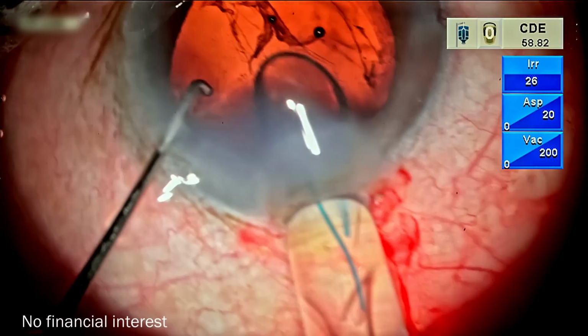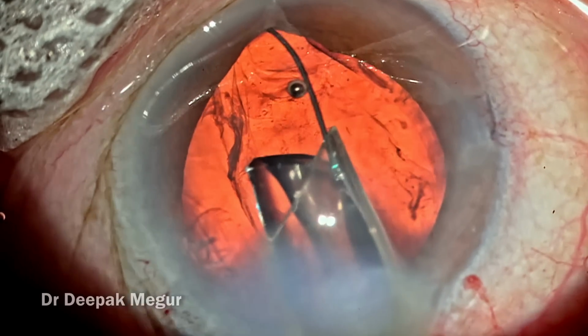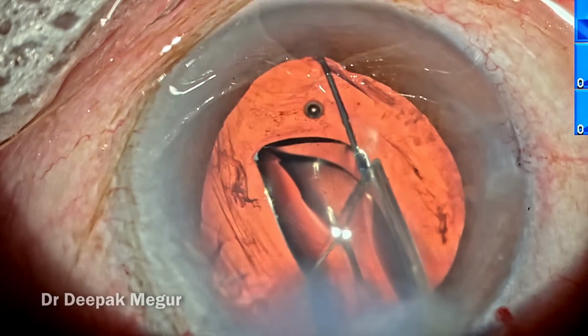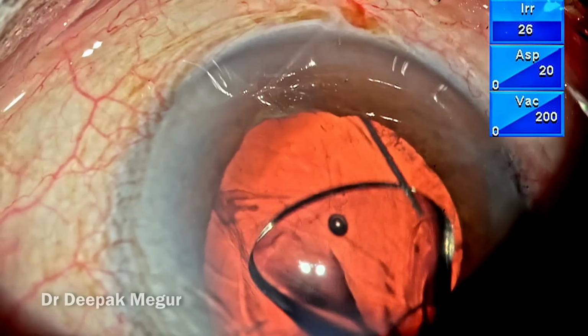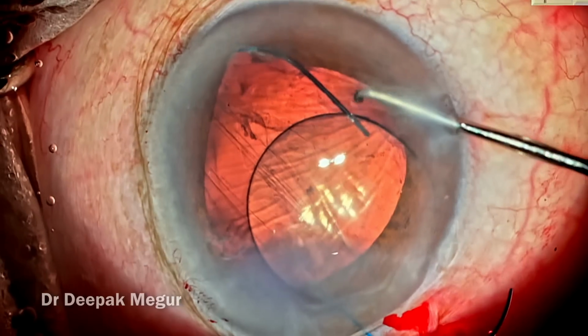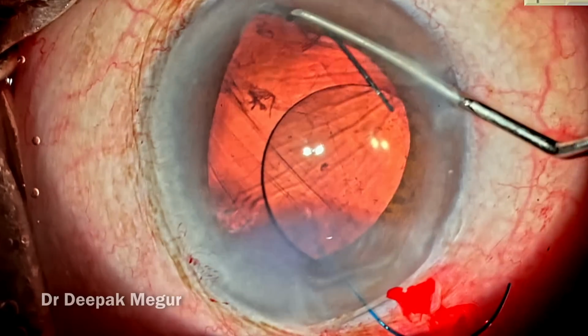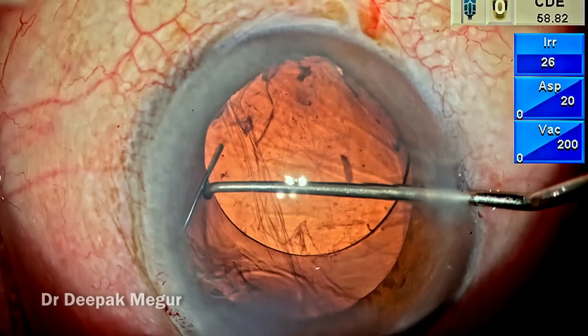This is Aurolab multi-piece lens. So I'm trying to land it over the anterior capsule, but unfortunately it has gone and stuck in the area where the anterior capsular tear is. So with the Sinskey hook, I just lift up the haptic so that it's in a more anterior plane and above the anterior capsule, and then using a Sinskey hook, the second haptic is dialed in place.